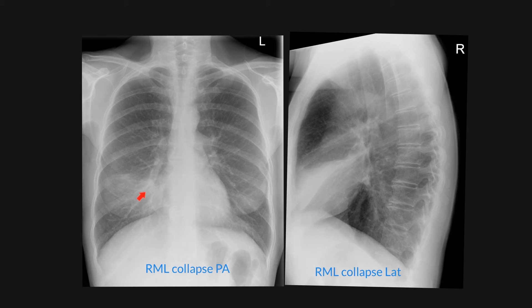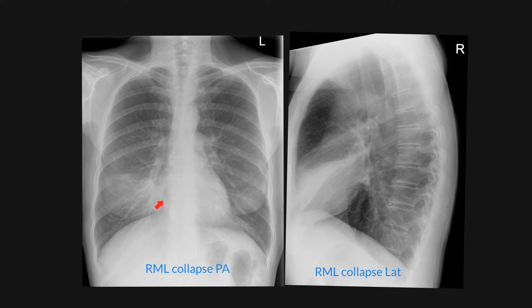Note also that the ribs are not as horizontal posteriorly as they are with the pectus excavatum, nor are the anterior ribs in an oblique fashion. The main differential diagnosis on the PA film is of a middle lobe collapse.